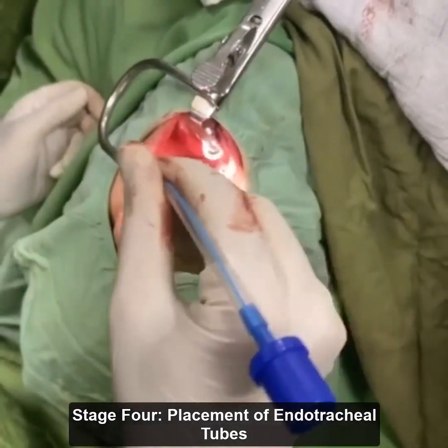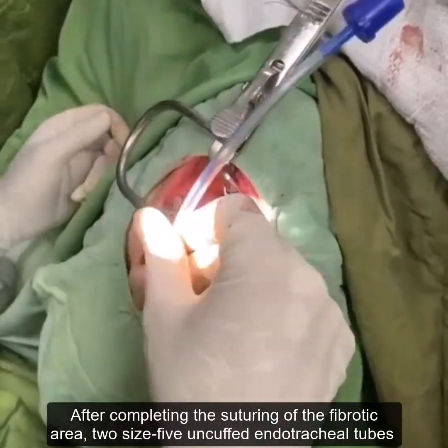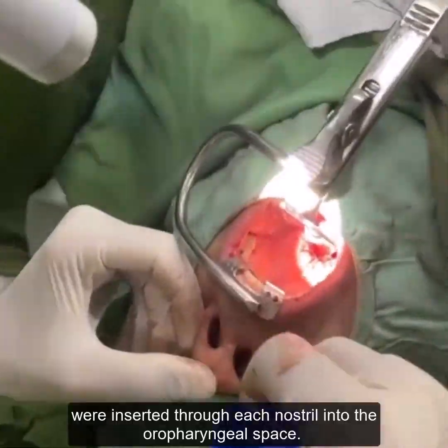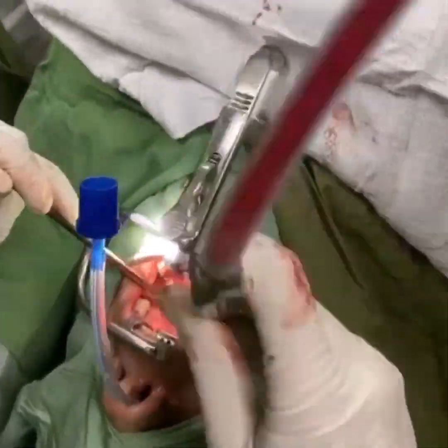Stage 4, Placement of endotracheal tubes. After completing the suturing of the fibrotic area, 2 size 5 uncuffed endotracheal tubes were inserted through each nostril into the oropharyngeal space.